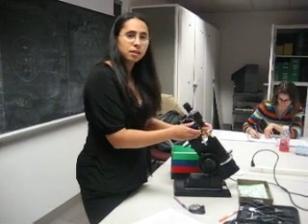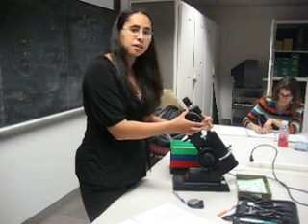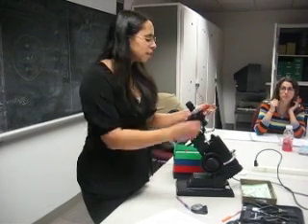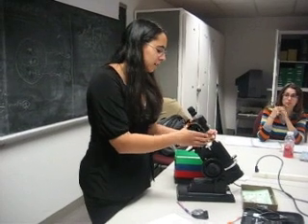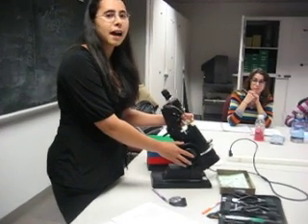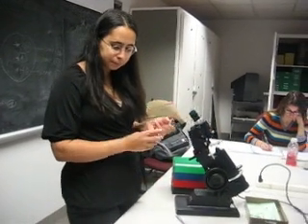Go ahead and flip it. Make sure you're not off on the distance, then put it into the reading to determine the add. The difference between the distance and the reading is the add. Don't forget that when you go into the distance portion, let's say you pick the 3 narrow lines, clear that up, know where you are. When you go into the reading, clear the narrow lines again. Don't clear the opposite that you started with because you just failed yourself doing it. So once you figured out the difference, that is your add power.